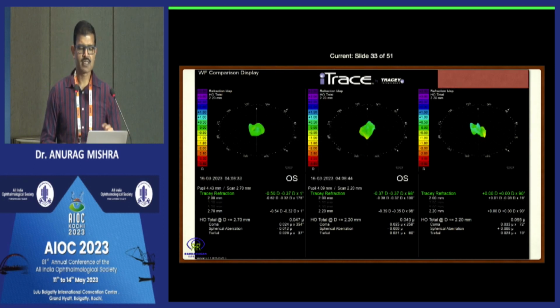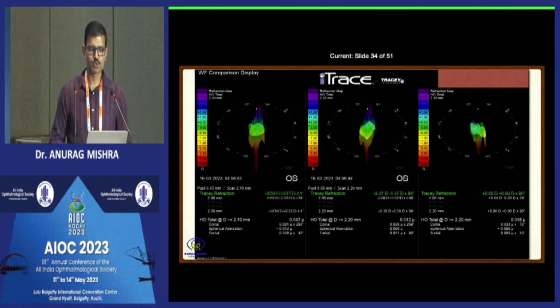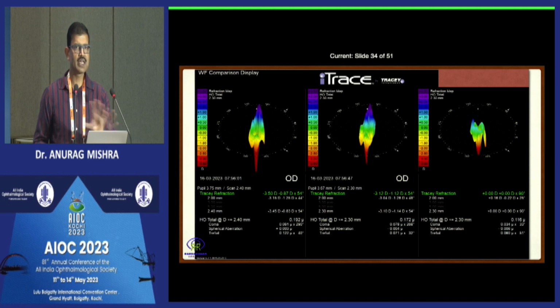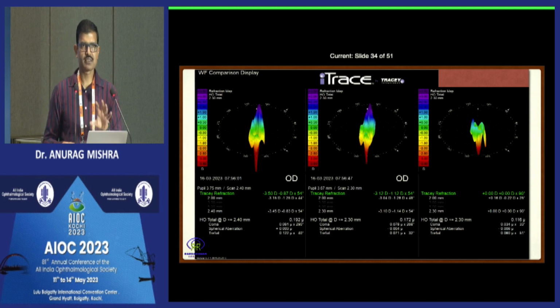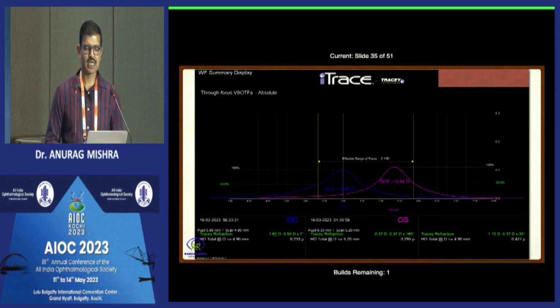Whereas in this, there is some amount of image distortion that is happening the moment the patient is trying to accommodate. This is a post-operative scenario. And this is very unsuitable as a refraction map because there is a distortion when the patient is trying to accommodate. Even without the accommodation, the patient is having some sort of distortion in the refraction map.